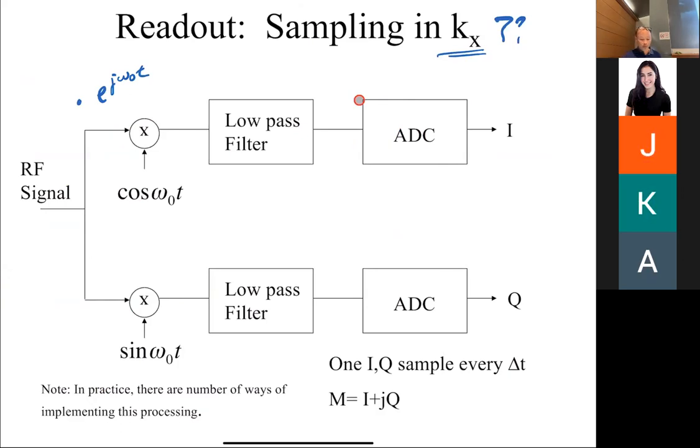If you're in EE, you've probably heard of analog digital converters. Everything in the world is basically an A to D converter or D to A converter now. On your iPhone, an A to D converter takes your voice and converts it to digital, and a D to A converter makes it audio again. Your camera, your voice, everything. So A to D and D to A converters are very useful, and also incredibly useful in MR.